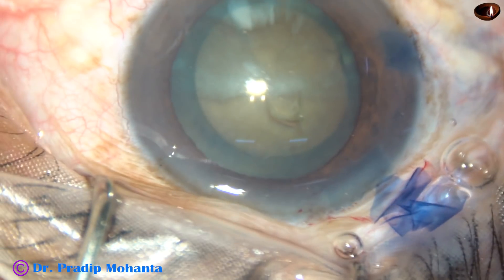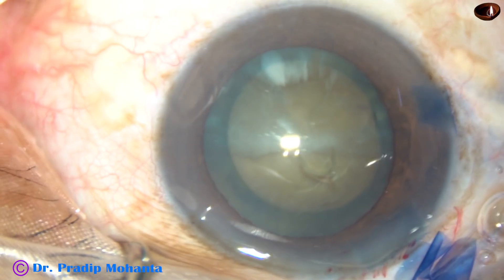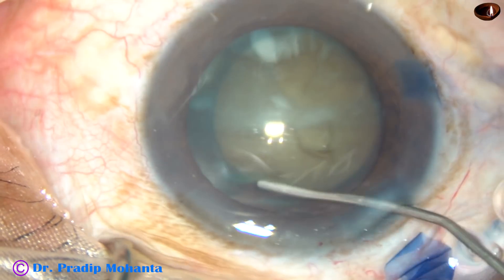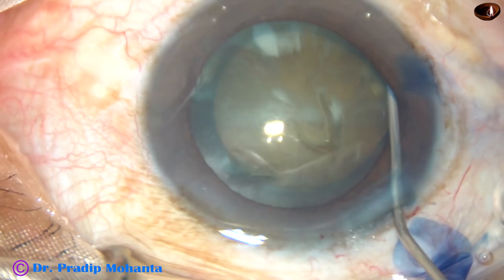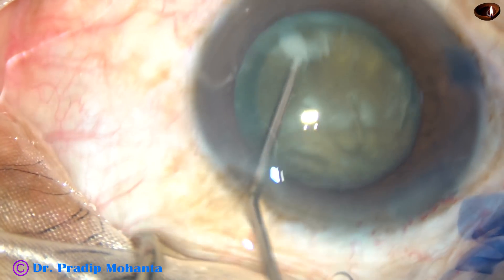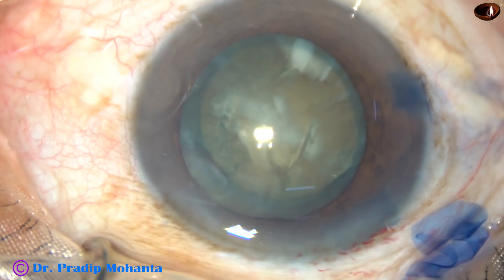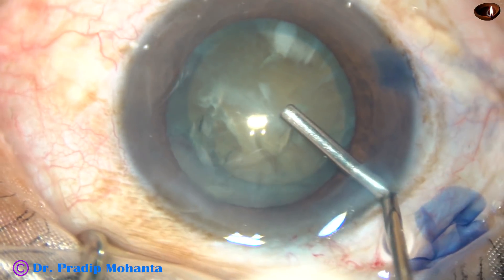And now, hydrodissection. BSS has been taken in a 2cc syringe attached to a 27-gauge cannula. The fluid is passed underneath the anterior capsular rim at several points. The nucleus is tapped and then mobilized — we could see that it rotated very nicely.